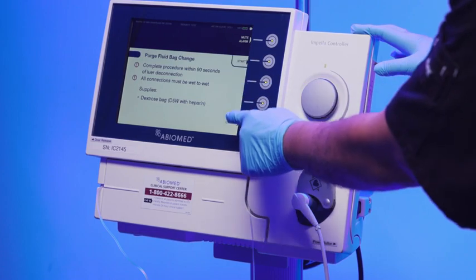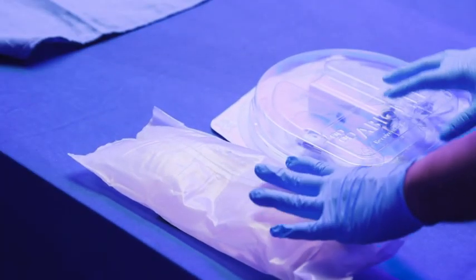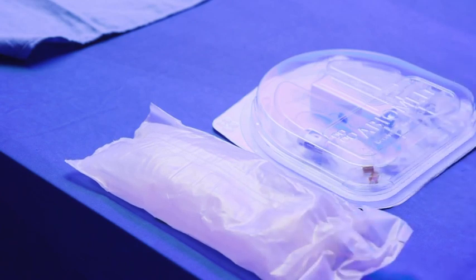This procedure should be completed within 90 seconds. Prior to starting, gather the supplies needed to complete this procedure, including a bag of dextrose 5% in water with heparin or sodium bicarbonate.